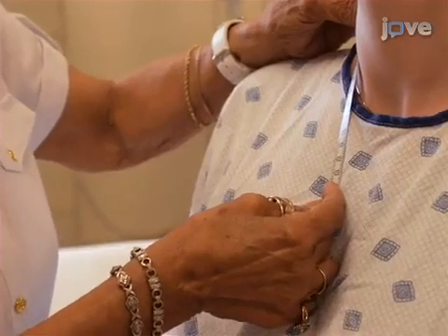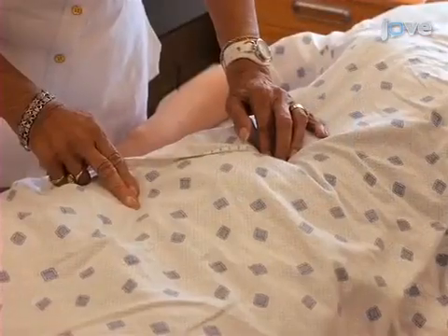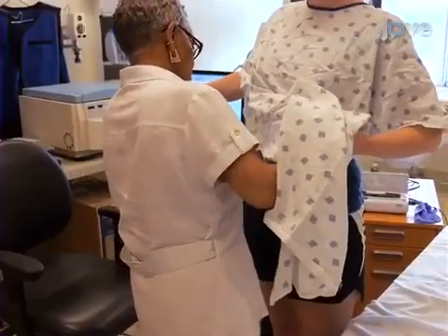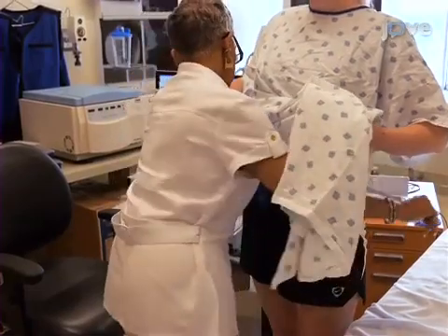Now measure the distance from the manubrium to the radial artery, the umbilicus to the femoral artery, and then the participant's waist and hip circumference, and record these values for entry.